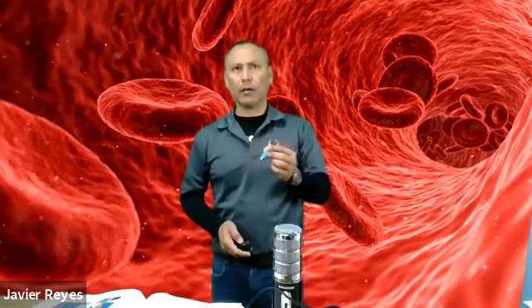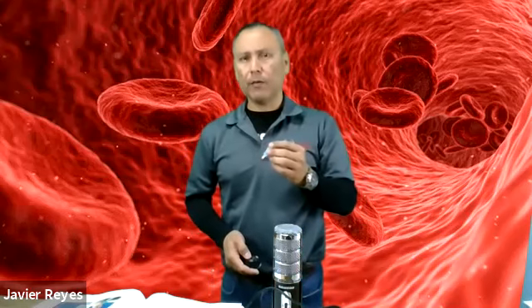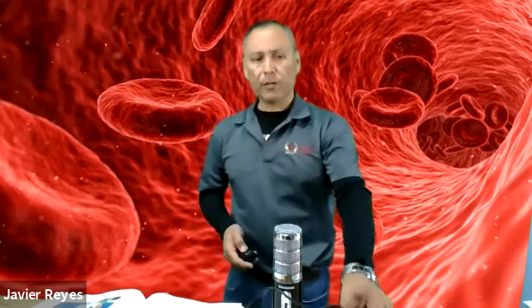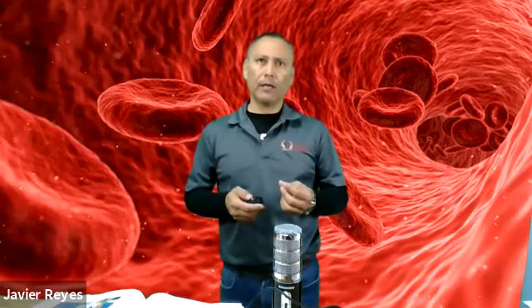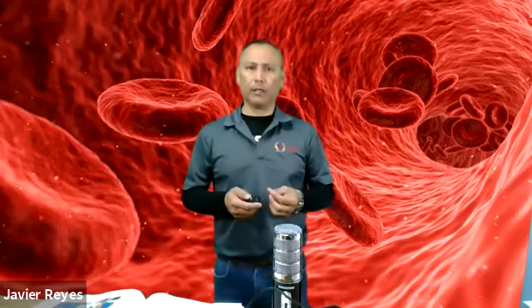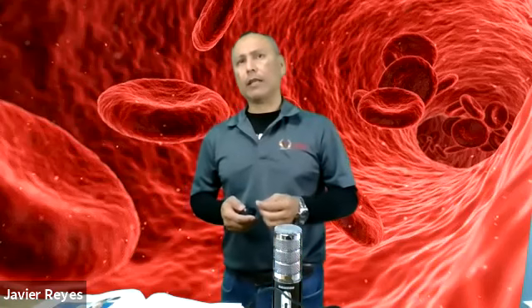Heel puncture lancets are a little bit different. If you look at the PowerPoint slides, you'll see that there are different colors again. They come in various shapes because of the depth of the puncture. Sometimes you need a deeper puncture, and you are able to collect a good amount of blood from that puncture, because the lancet device itself has a wider blade, and it makes a bigger cut, and won't have as much trouble collecting the specimen versus using the regular lancet device.